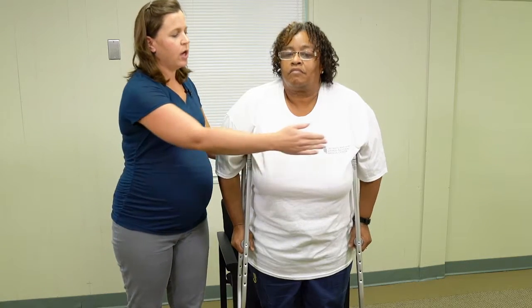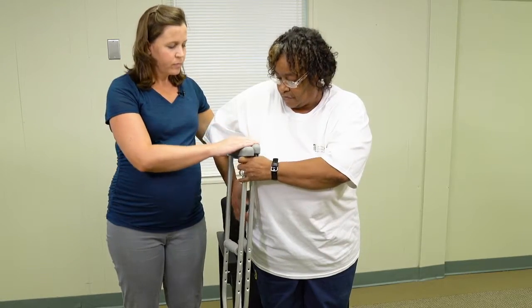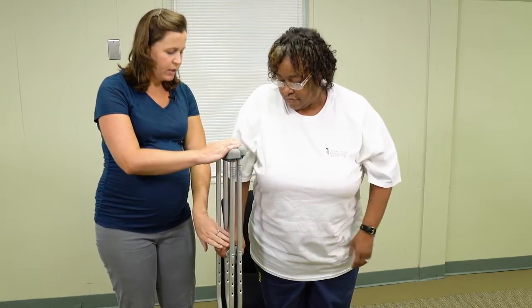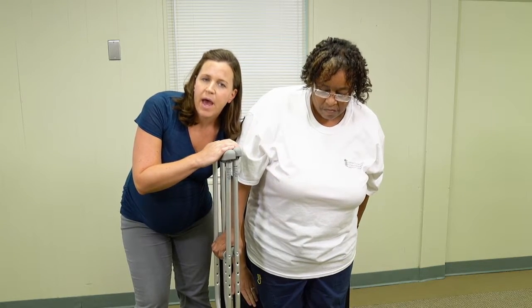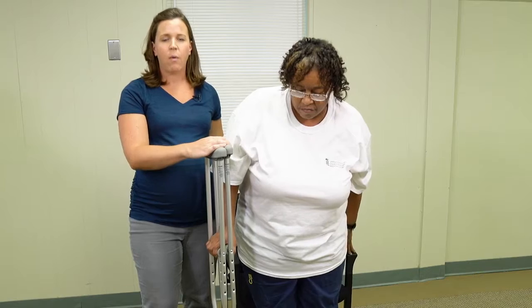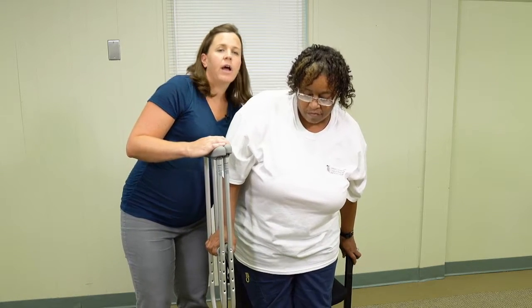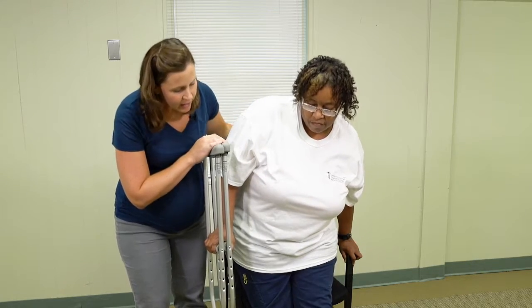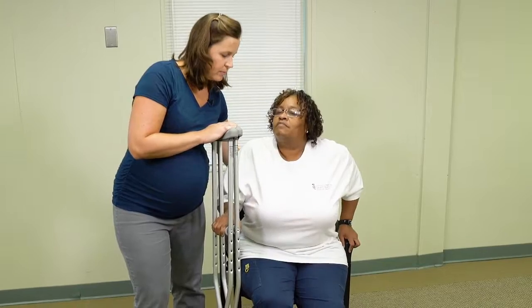If you're ready to sit back down, you're going to bring the crutch back over to the same side. Replace your hand here. Make sure that you've already scooted back to the chair or the bed so that both legs are touching. That way you know you're going to sit on something. You can reach back with your other hand for that armrest. And then again, stick that leg out to take some pressure off and slowly sit down.